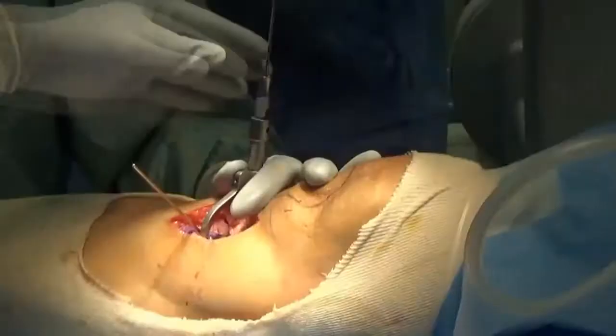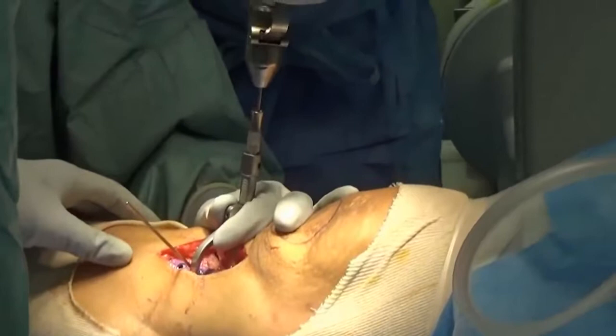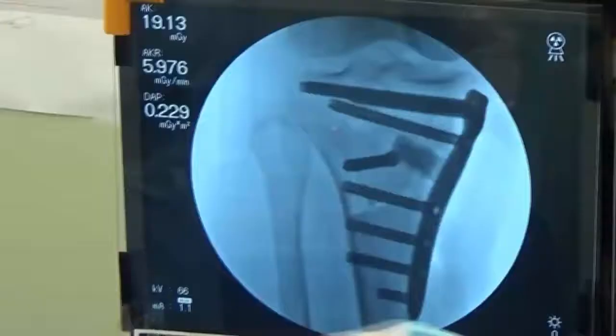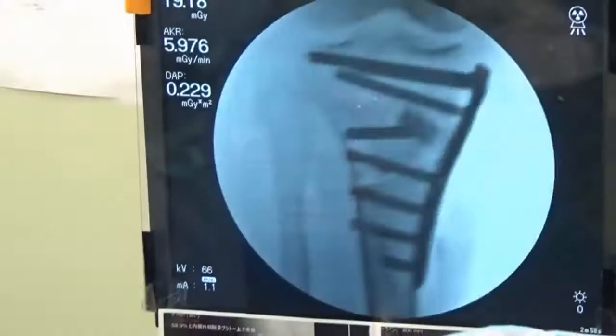Finally, bicortical screw fixation from the distal part of the tubercle to the tibia is performed using the tuberosity screw device, which also protects the popliteal neurovascular bundle. This is the fluoroscopic image after OWDTO. There is full knee flexion and extension postoperatively.